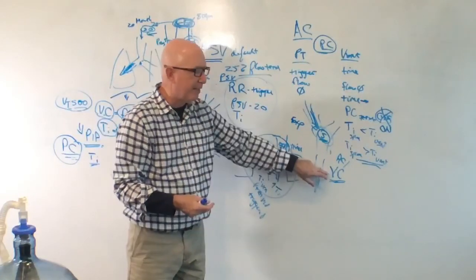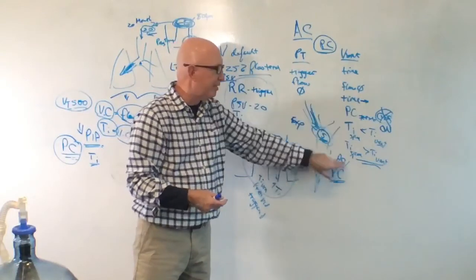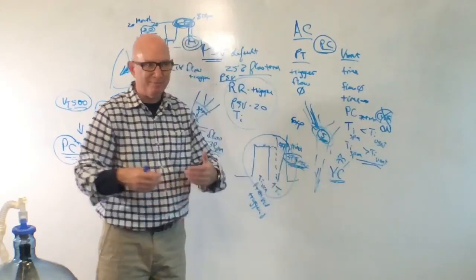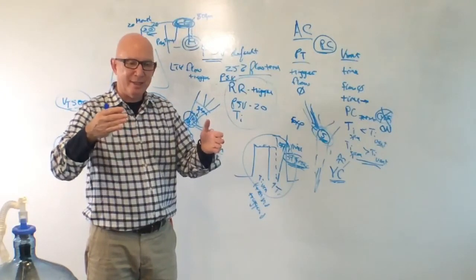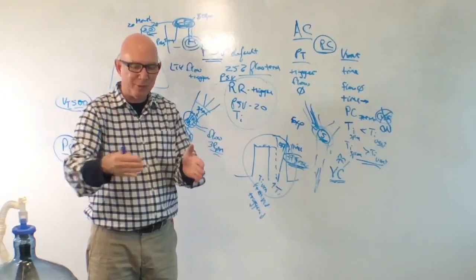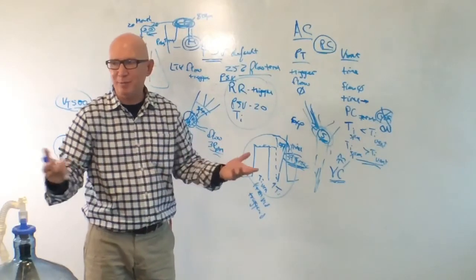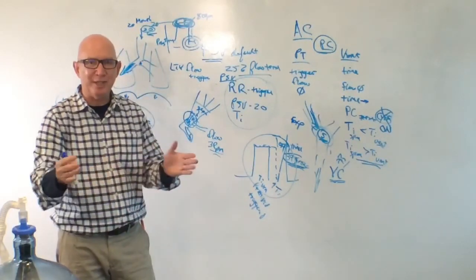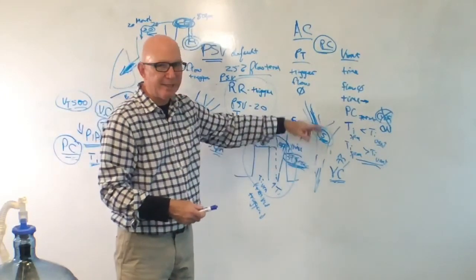And if they're inhaling for shorter, if they want a shorter I time, they can't have it because there's no termination for a volume control breath, because the machine's goal is to deliver a volume, and it says, I need to deliver that volume within this period of time. So if you shorten the I time, the machine can't accelerate the flow to try to get that volume in. And it has no idea that you or your patient are going to do that shortening. So that leads to asynchrony with your patient.